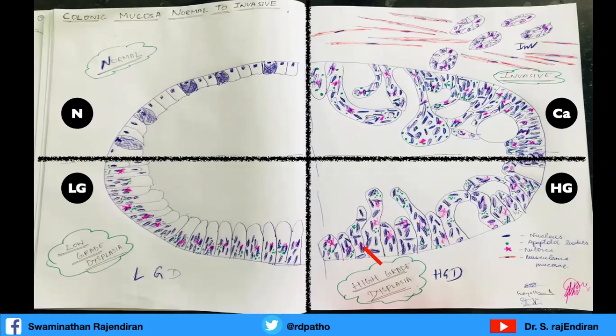When you come to this quadrant, you see the stratified nuclei showing micropapillary formation, and when these micropapillae fuse together, they form the cribriforming. And here you can see the stratified nuclei are reaching the top of the apical membrane, and they are running in different directions.